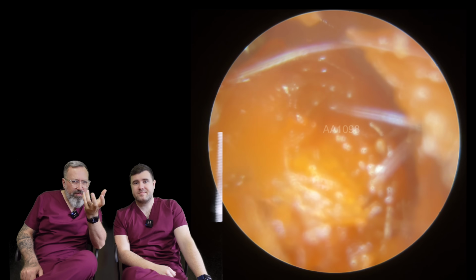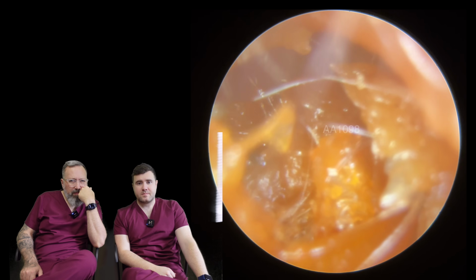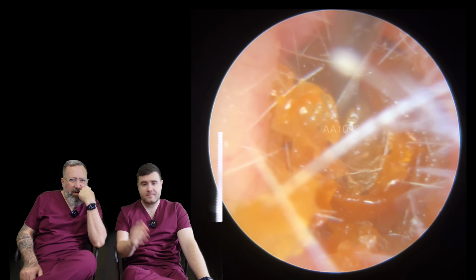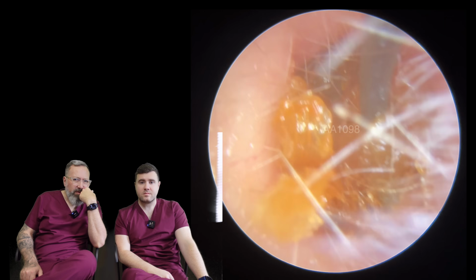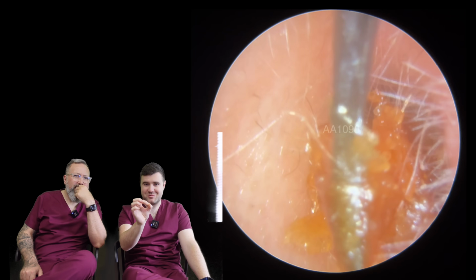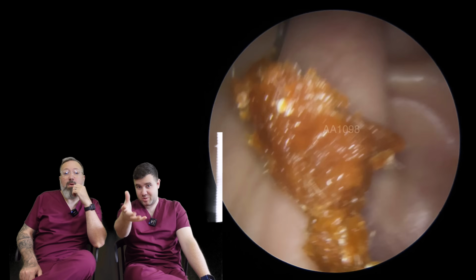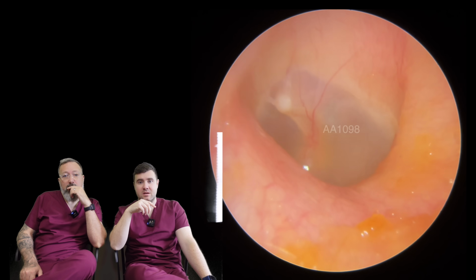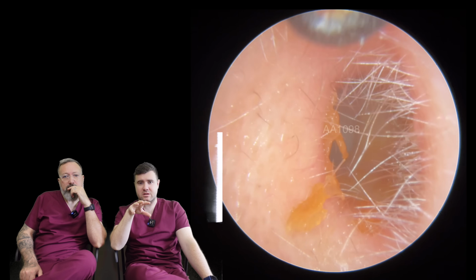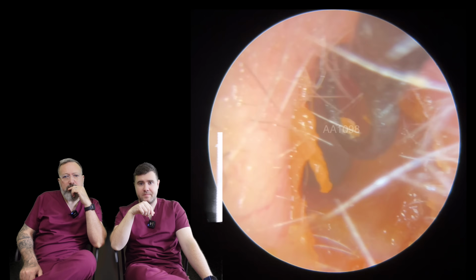There's still quite a tough kind of husk around it, isn't it, of skin? Yeah. Look at that. If you can get into the outer section, that's going to work brilliantly. Yeah, you can see. Luckily, there was a really tough bit of skin, and that was just holding on. So that's pulled most of that forward. So there we are. You can see the eardrum nice and clear there. Really shiny. I can't remember if I go in with the Jobson horn to try and clean some of this up.